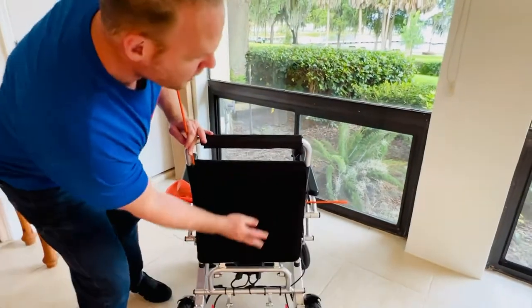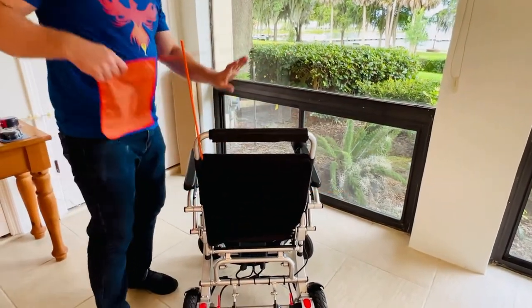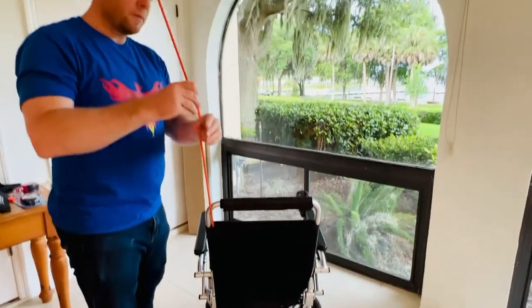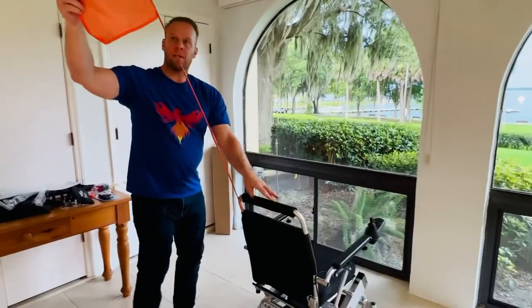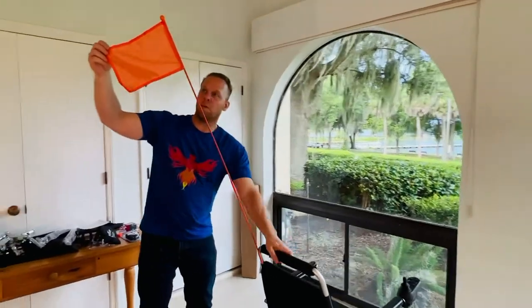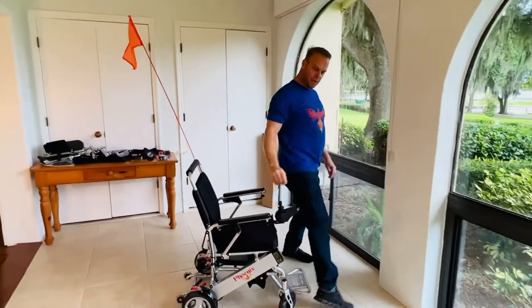I'm going to thread the seat cushion back through and then very simply take the attachment — and there you go, you have the foldable safety flag. This is great for city driving or enhanced visibility.